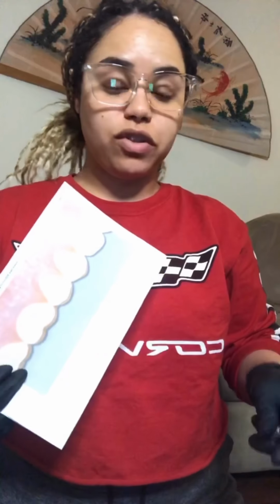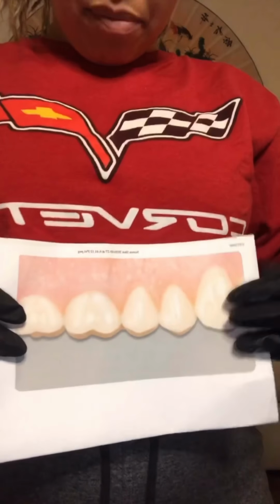Lastly, we're going to be doing the upper right lingual surface. So you're going to be sitting 10 to 12. Your patient is still supine, and you will definitely be using indirect vision. So you are using indirect vision on that one, and I will show you up close what that looks like. When you're working on the upper right posterior lingual surface, it's all indirect vision, so I thought I would demonstrate indirect vision. So this is how I would see it in the mirror.